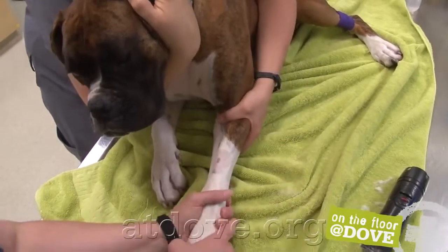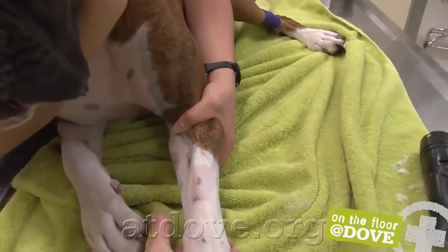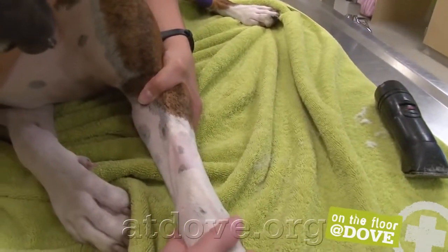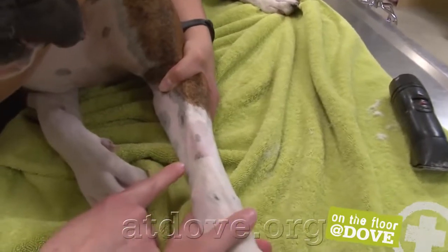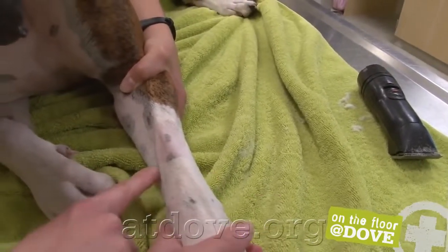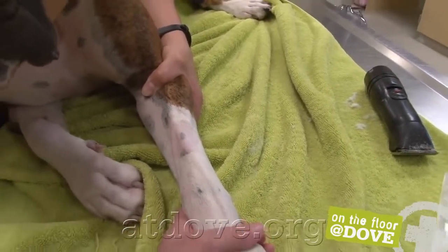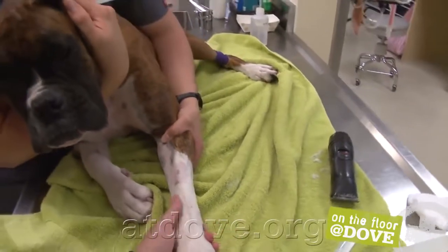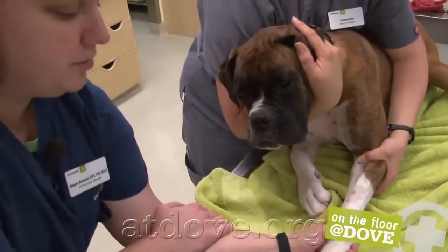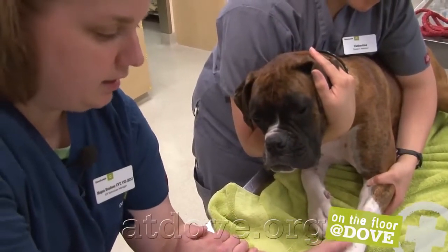It's really easy on this dog to see this kind of accessory vein that runs down along the side there. That is not a good choice to place an IV catheter. The problem being is a lot of times your catheter is going to come out right there. Here's her carpus, there's your catheter. You're going to have all this tape down here. It's going to be on the lateral aspect of her leg. It's probably going to clot easily. Your fluid pump's going to give you problems. So try and stay away from that accessory branch of the cephalic vein if you can at all.